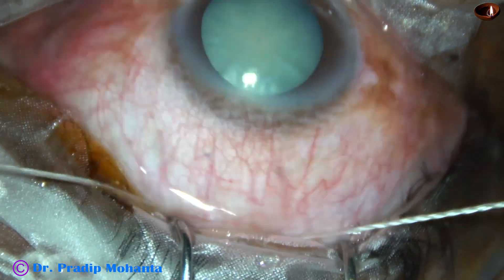My plan is just to oppose the lips, not to make it a tight suture, because the idea is to reduce the astigmatism. This is a very mild pull, and the wound gap is gone. Whatever mistake I have done by making a large wound near the limbus, I have corrected that by putting this suture.